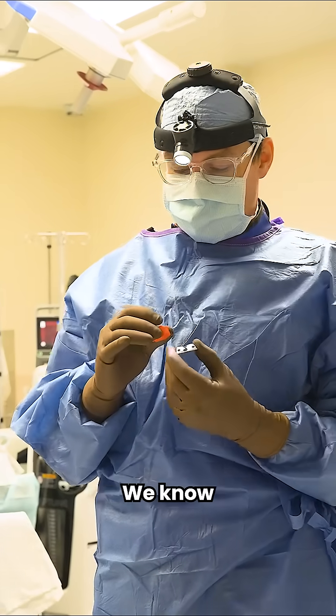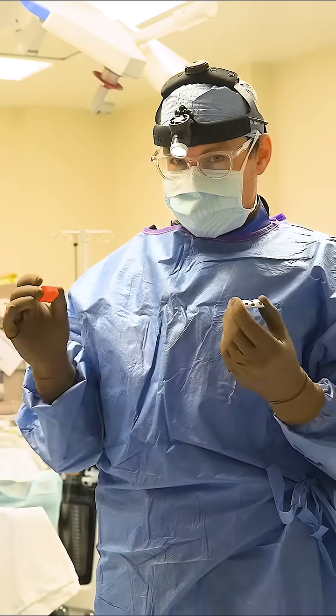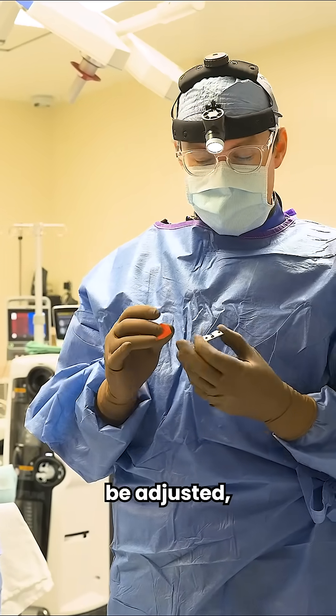We already have a very good plan — we know the size of implants and where we're cutting — but intraoperatively things can always change or need to be slightly adjusted.